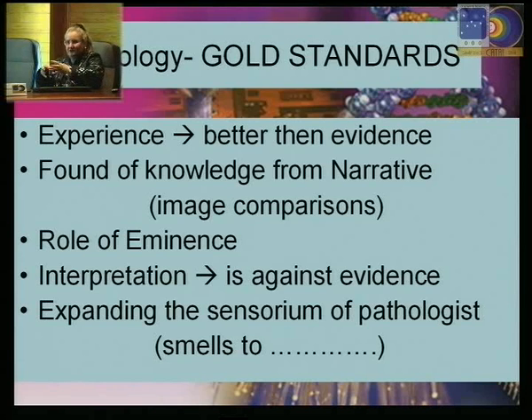I say the pathologist because the endoscopists behave in a different manner. They are not based on images, they are based on evidence-based medicine. So how can you bring the knowledge to pathology? The only way is to bring sufficient image comparisons and even to let the system automatically find the comparisons in order to help them make the diagnosis.